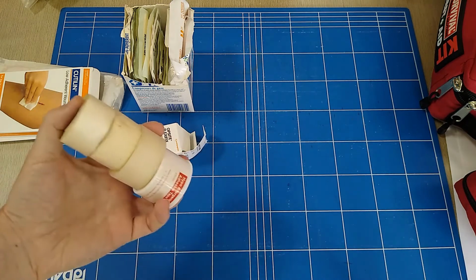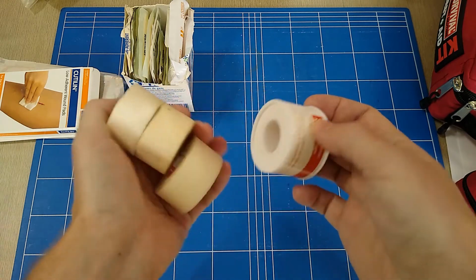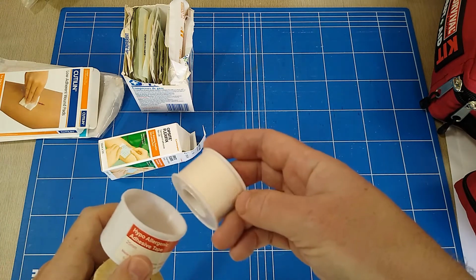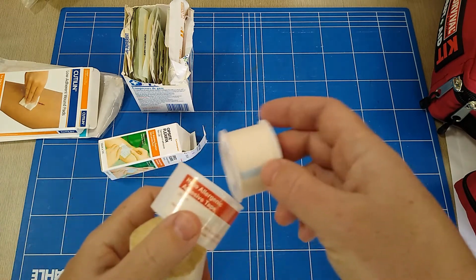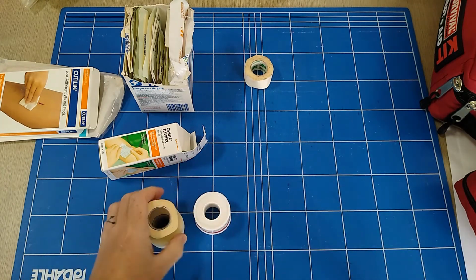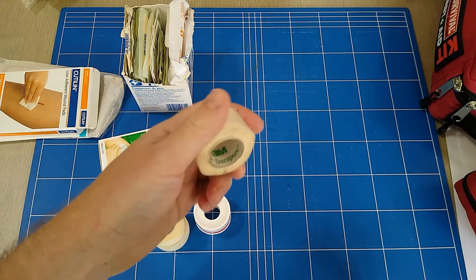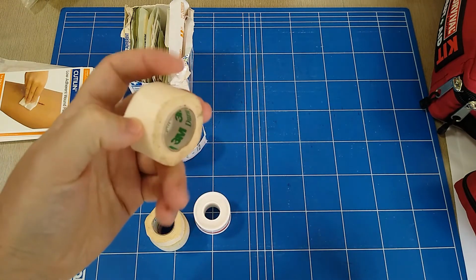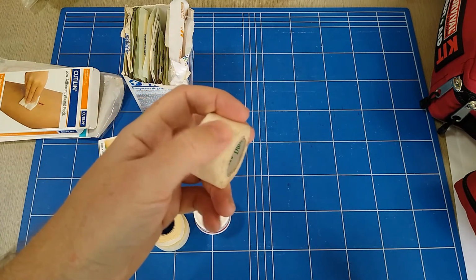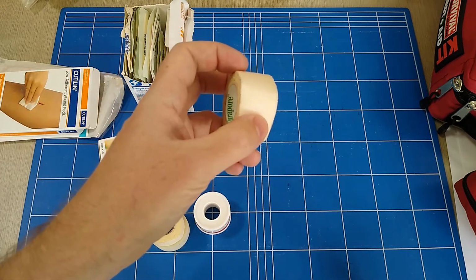So, tape. We've got a bunch of different kinds of tape. Now, why do you need different kinds of tape? Well, on the one hand, you can have different allergies for different things, and how well you want tape to stick is actually kind of important. So this stuff, it's 3M, so anybody can get it. It's Durapore. It's kind of a smooth white fabric tape, okay? This stuff sticks really, really, really well, okay?